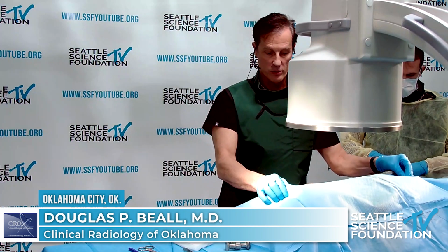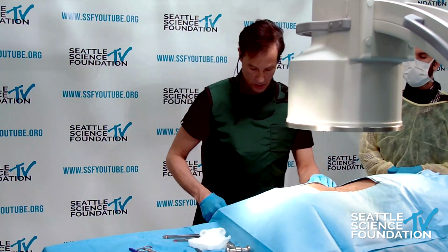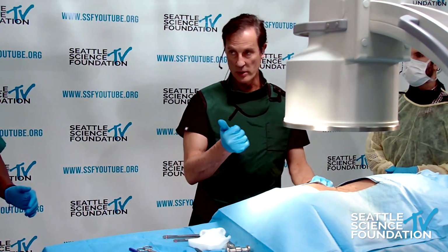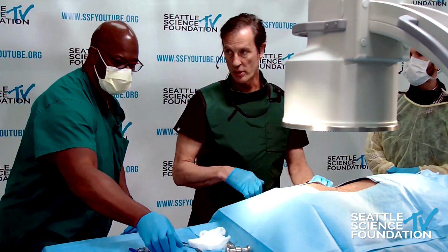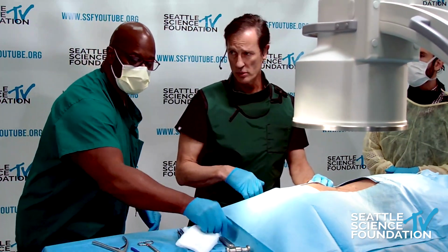So we're going to do a few things, and we're going to start off with some of various and sundry approaches. So we're going to go from that to balloon kyphoplasty. We'll talk about tumor ablation, and we'll also talk about spine jack after the balloon kyphoplasty, so in that order. So what we'll do here, first off, we will go a little bit north or superior. I'm going to show a few different approaches.